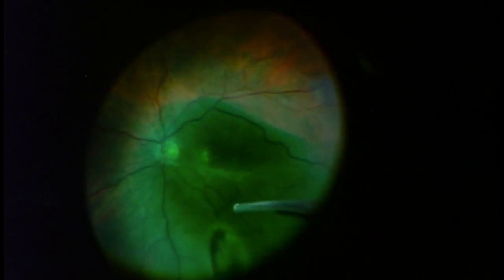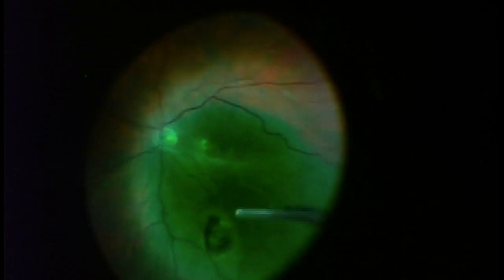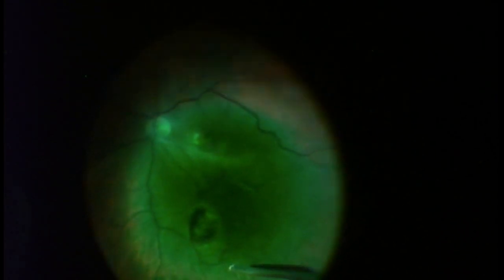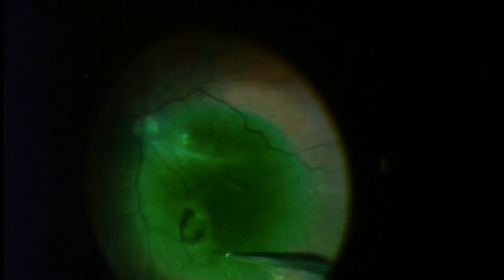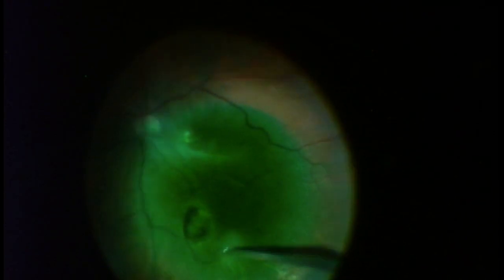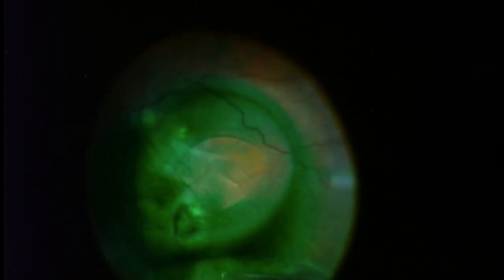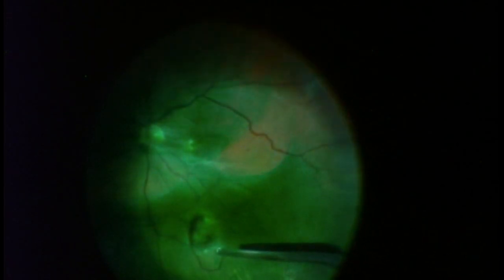What I'm doing now is letting the dye soak in, or marinate the retina. In just a few seconds, I'm going to start aspirating or removing the excess dye off the surface of the retina. Now, there is a tube which you cannot see, which is pumping fluid into the eye.